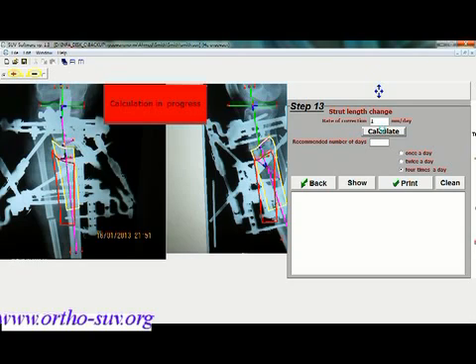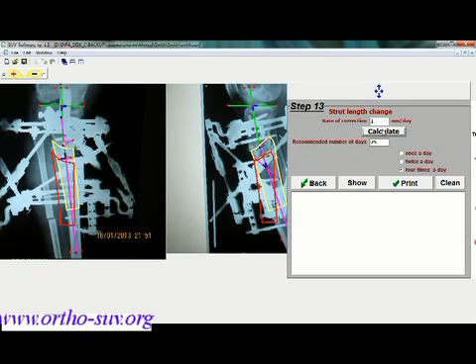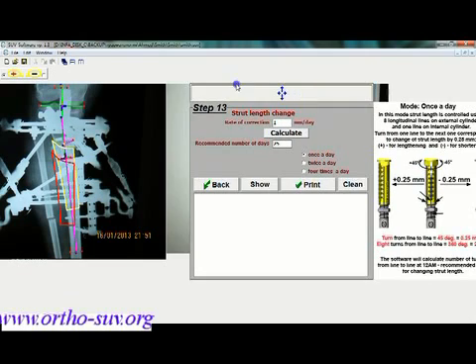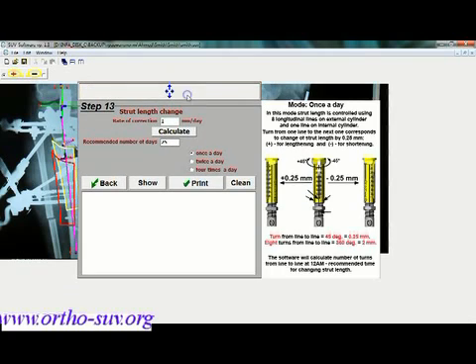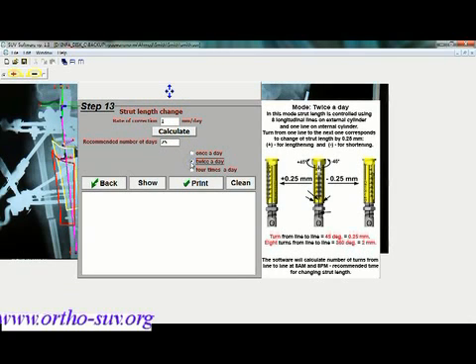Now the software calculated 26 days for deformity correction. We can use this calculation or we can disagree with the software if we are experienced orthopedic surgeons. We also have to choose a mode of deformity correction.